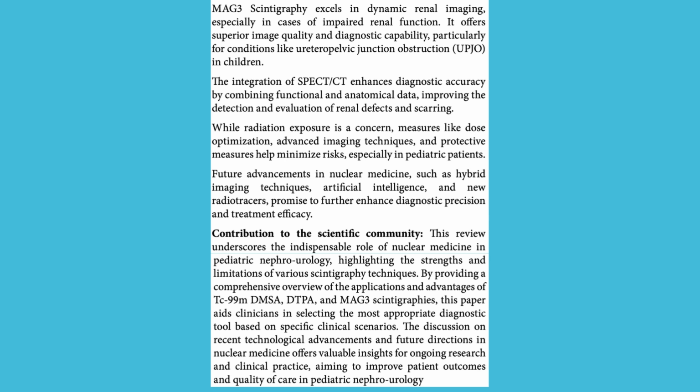MAG3 scintigraphy excels in dynamic renal imaging, especially in cases of impaired renal function. It offers superior image quality and diagnostic capability, particularly for conditions like ureteropelvic junction obstruction, UPJO, in children. The integration of SPECT/CT enhances diagnostic accuracy by combining functional and anatomical data, improving the detection and evaluation of renal defects and scarring.